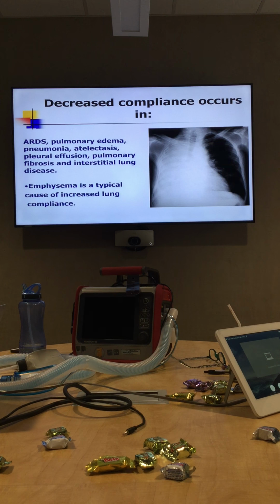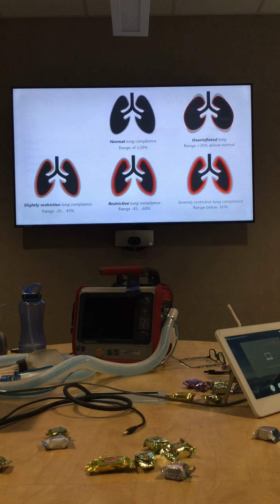A lot of those small volumes and faster rates are what we're going to start ventilating patients with, rather than those big, let's give them 1,000 cc tidal volume and say, here you go, we can manage your gases this way. That doesn't really work. And obviously emphysema is a patient that's going to have a very large compliance.